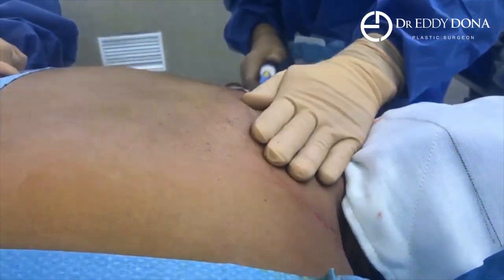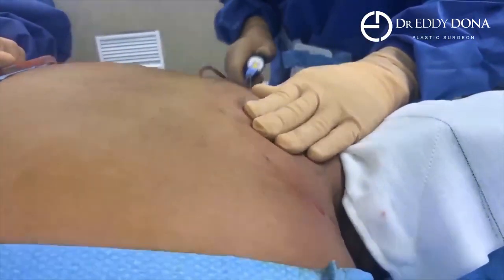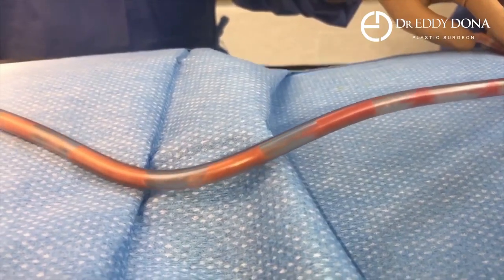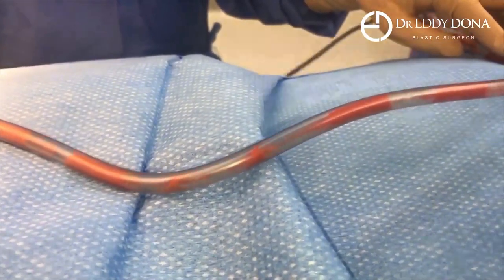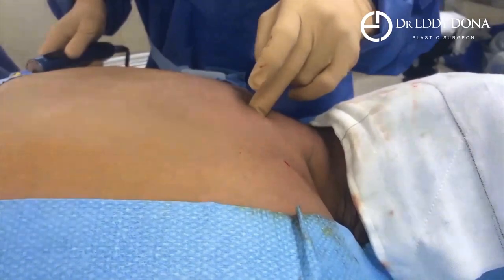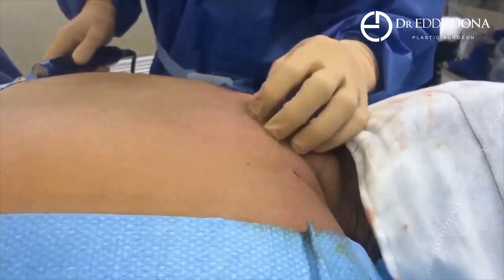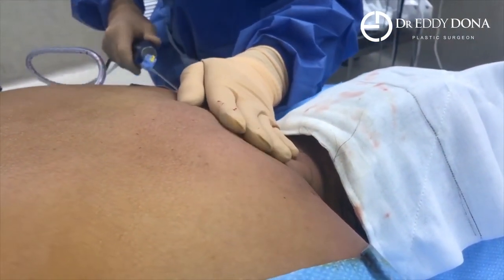Now we're suctioning out and extracting that fat from the area. We're almost all done — that's much, much better, much thinner through there, pretty much just onto the bone. You can see when you do a pinch test there's nothing else there, just the skin. It's looking really good; just doing one final pass of liposuction.